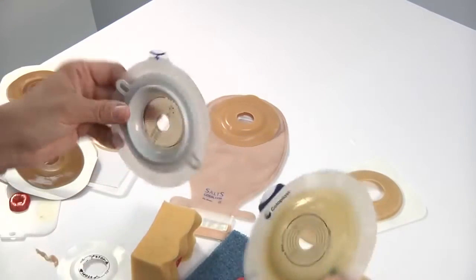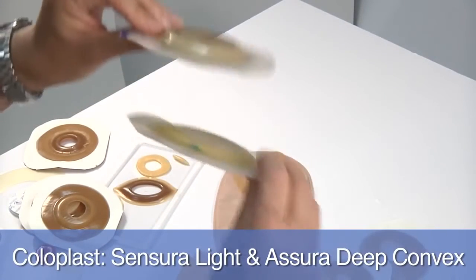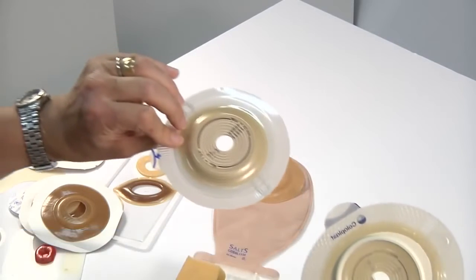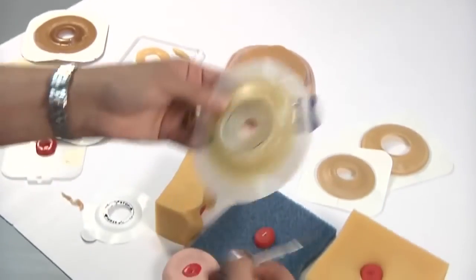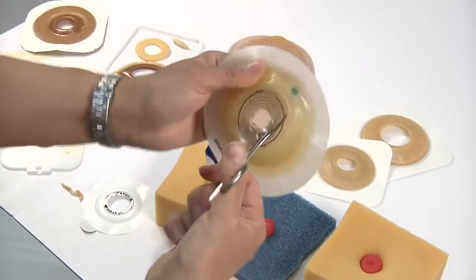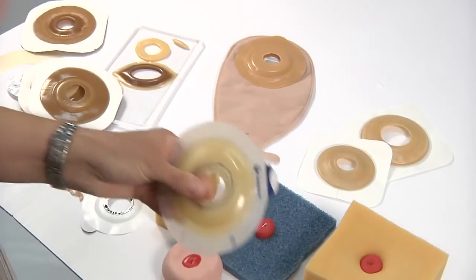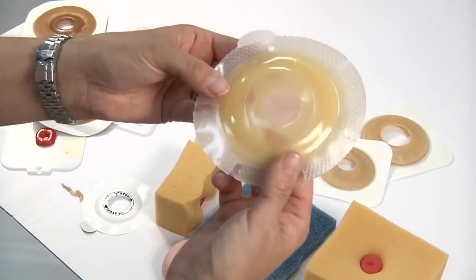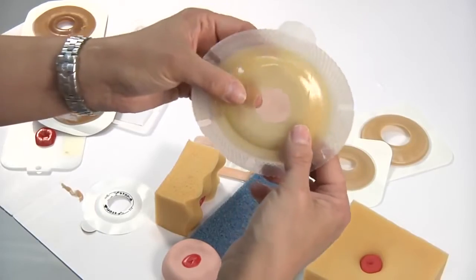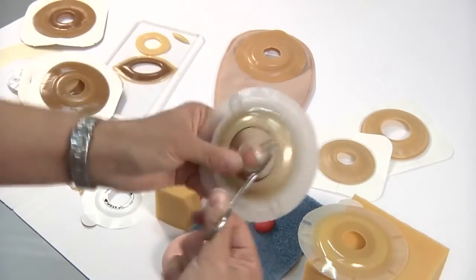And lastly, from Coloplast, they have two differing depths. They've got their Censura, what they call light convex, and this is their deep convex. These are both cut to fit, but they do have them available as pre-cut sizes as well. And again, these ones are a little bit different than the other two that are cut to fit, in that when you actually cut into this, it actually keeps its rigidity just a teensy bit more. Maybe not so much with the Censura here, certainly when you use that with the Assura. I'll give that a bit of a cut there.